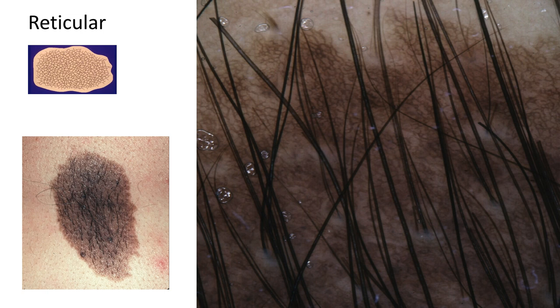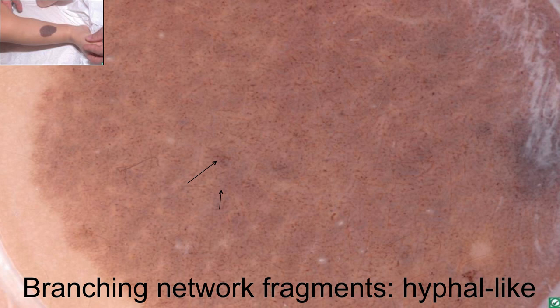The reticular pattern. Here we have a classic example of a congenital nevus. We see brown lines that form a grid-like pattern with hypopigmented holes. This is a reticular pattern — symmetric and uniform throughout the entire lesion.